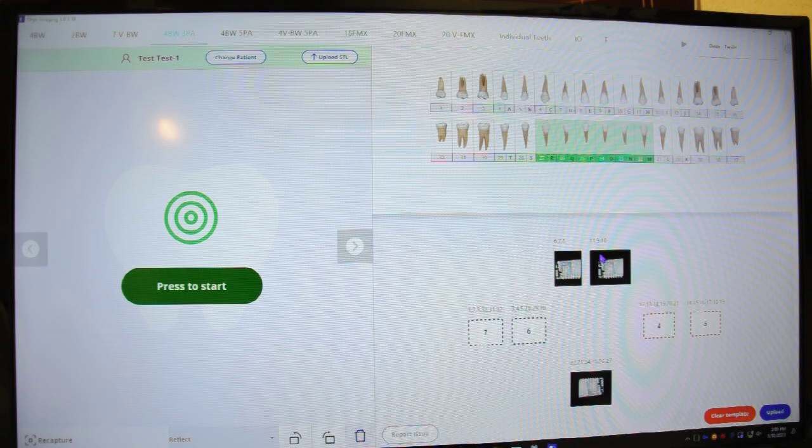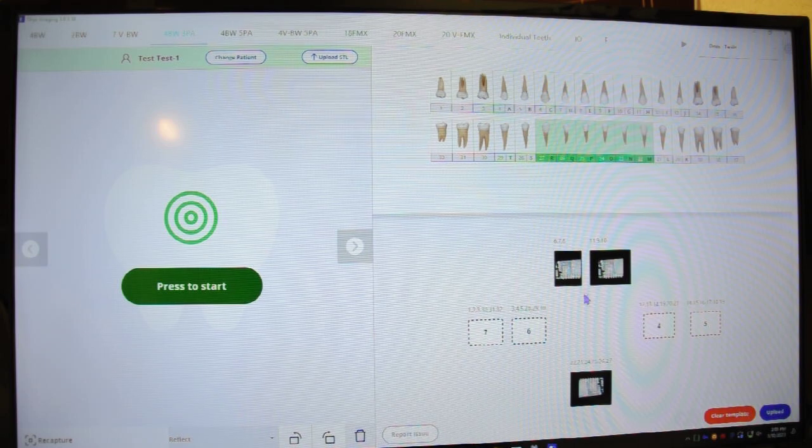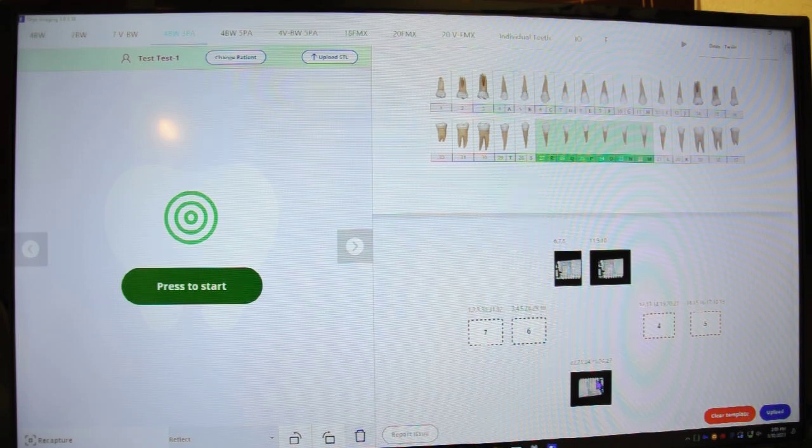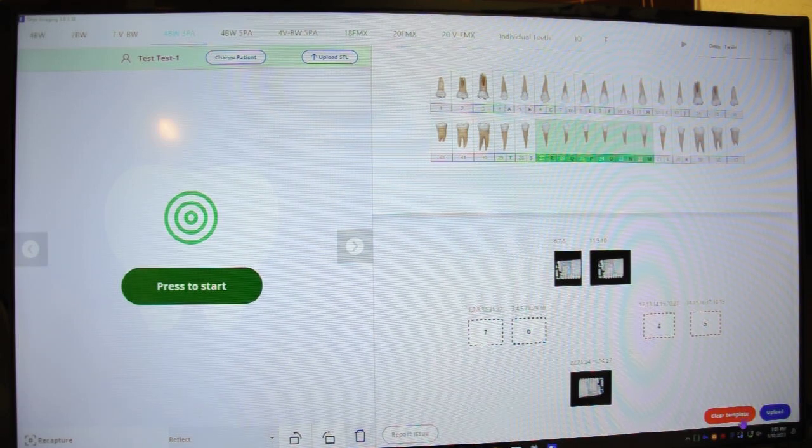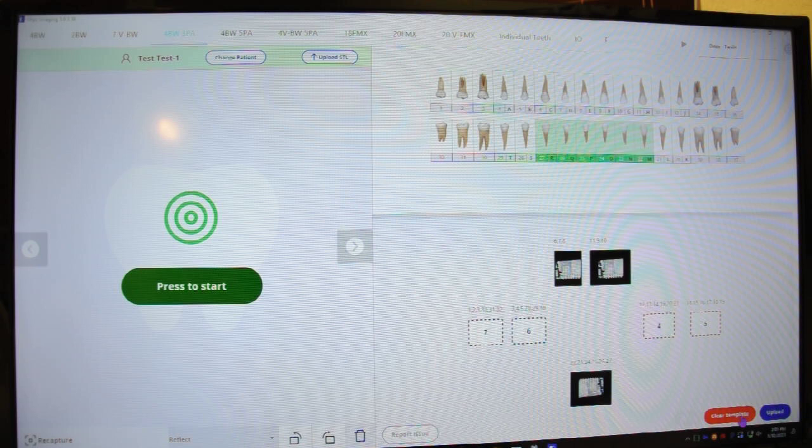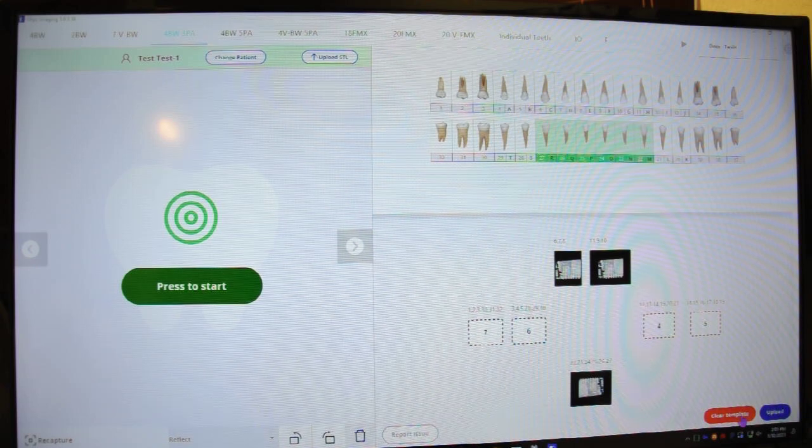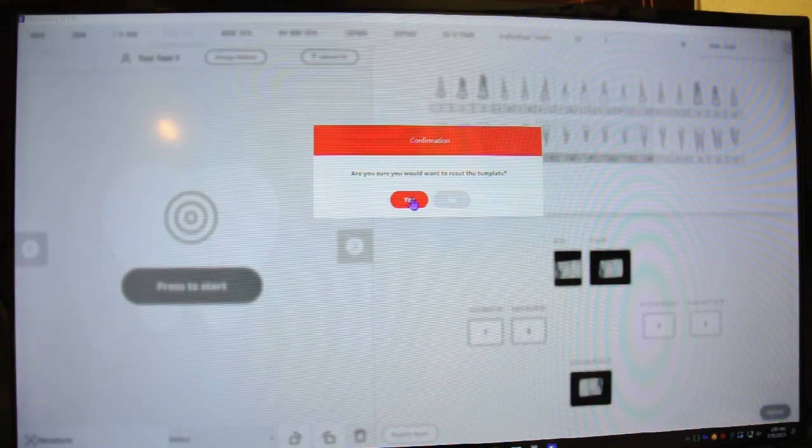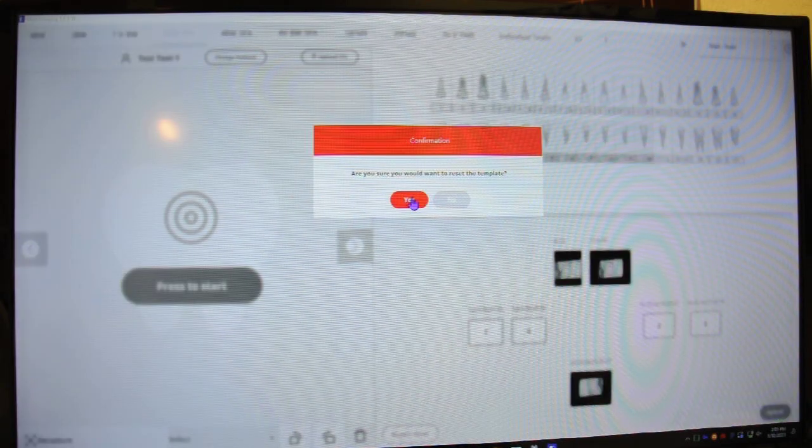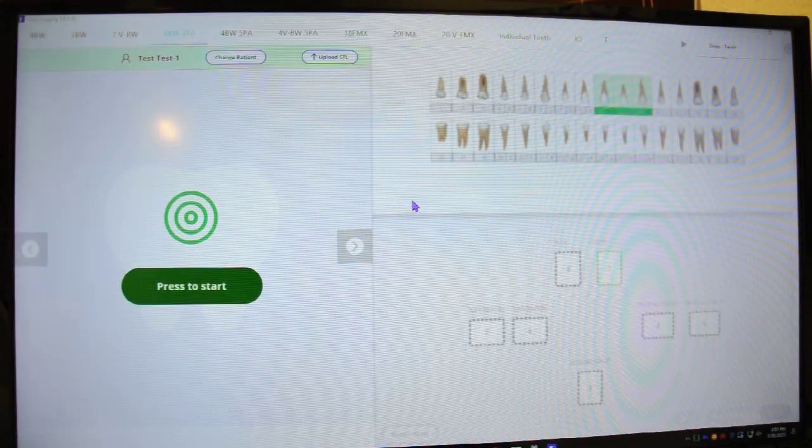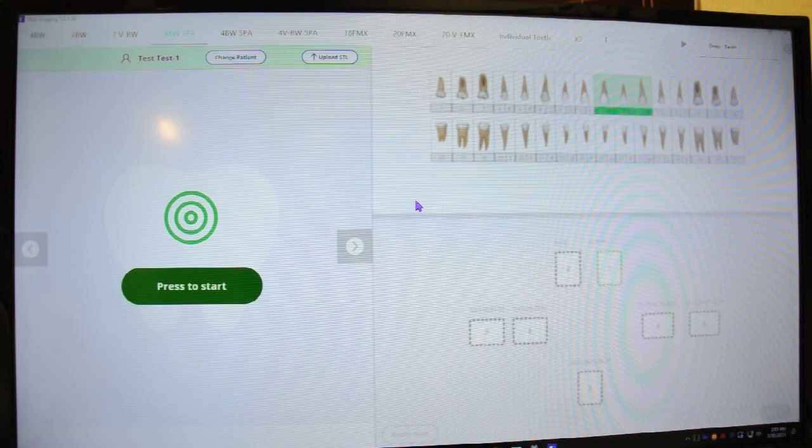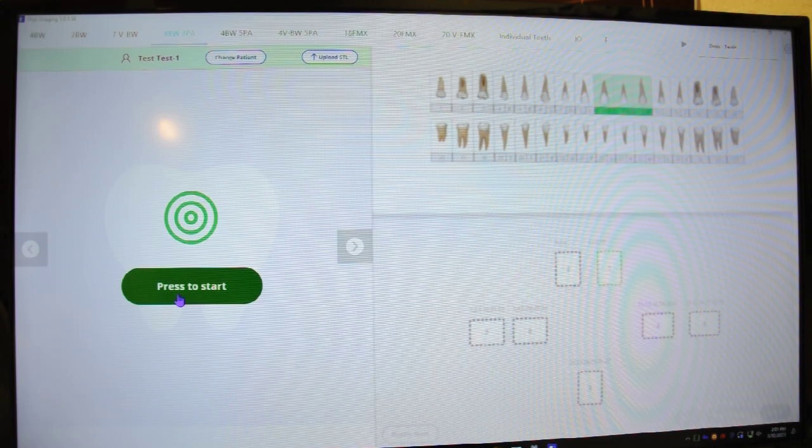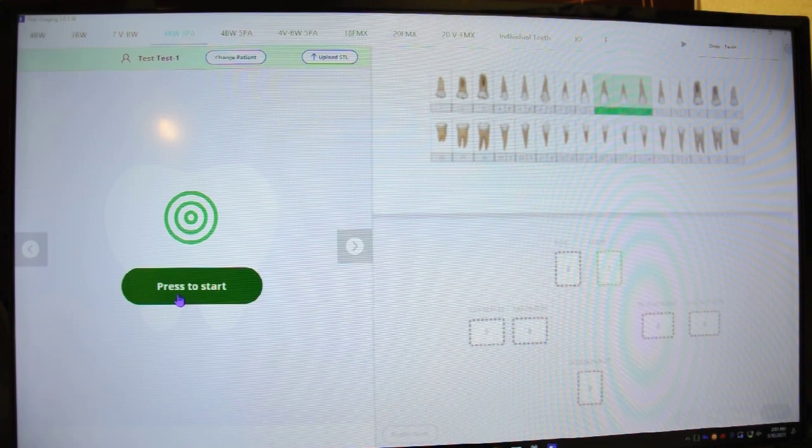For some reason, we have these old images populated here. So I'm just going to go ahead and clear this template and start new. I'm going to click yes to reset it. And now we're going to hit the start button.